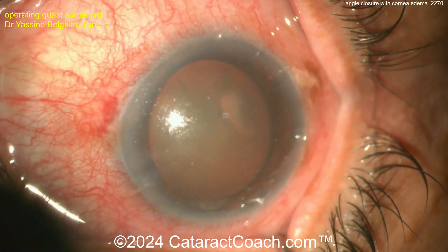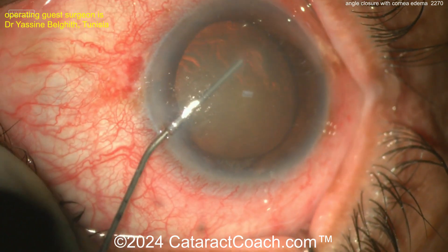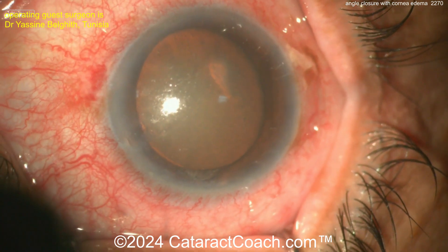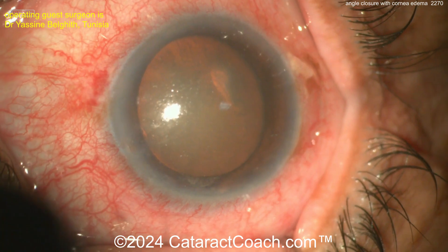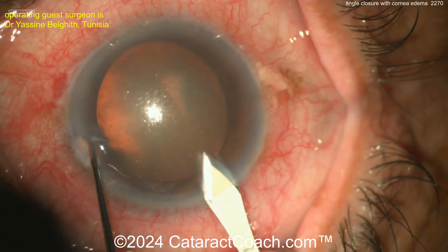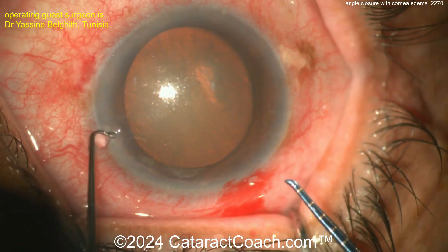This patient was unable to get a good peripheral iridotomy done with the YAG laser in the clinic, so let's just solve this issue — let's make the patient pseudophakic. We interviewed Johnny Gayton on the CataractCoach podcast, and he was the one who first described that the best treatment for shallow AC and narrow angles or angle closure is to make the patient pseudophakic.